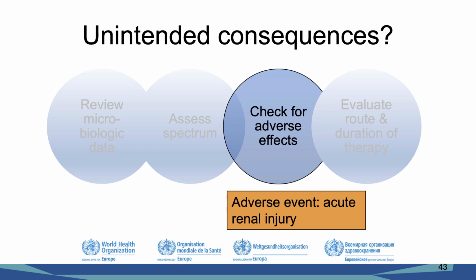This case illustrates an adverse event resulting from inappropriate antibiotic treatment that was selected based on misinterpretation of a culture result representing wound colonization rather than true infection. In addition, it demonstrates that the results of a superficial swab can be quite different from that of a deep, sterile specimen.